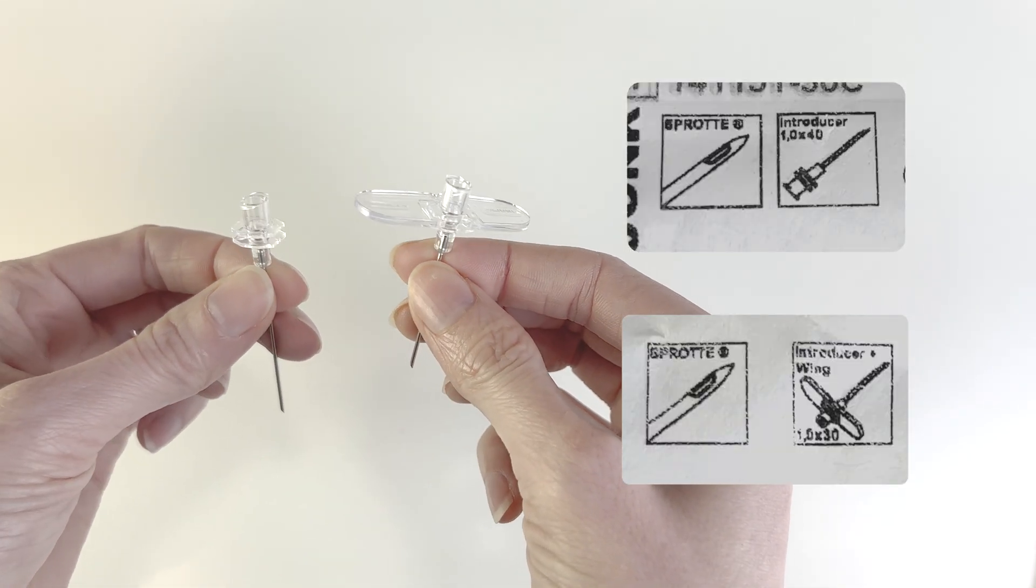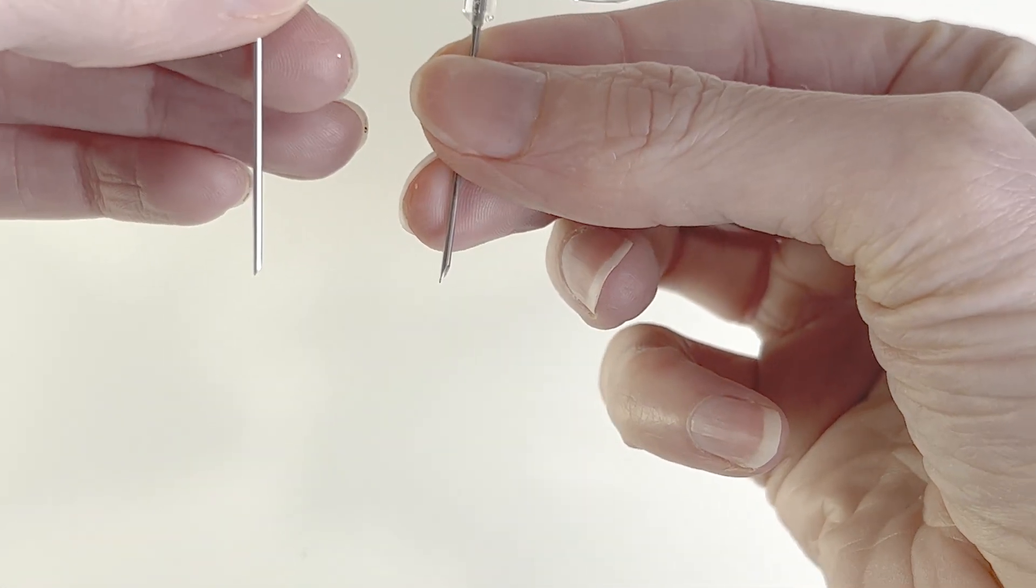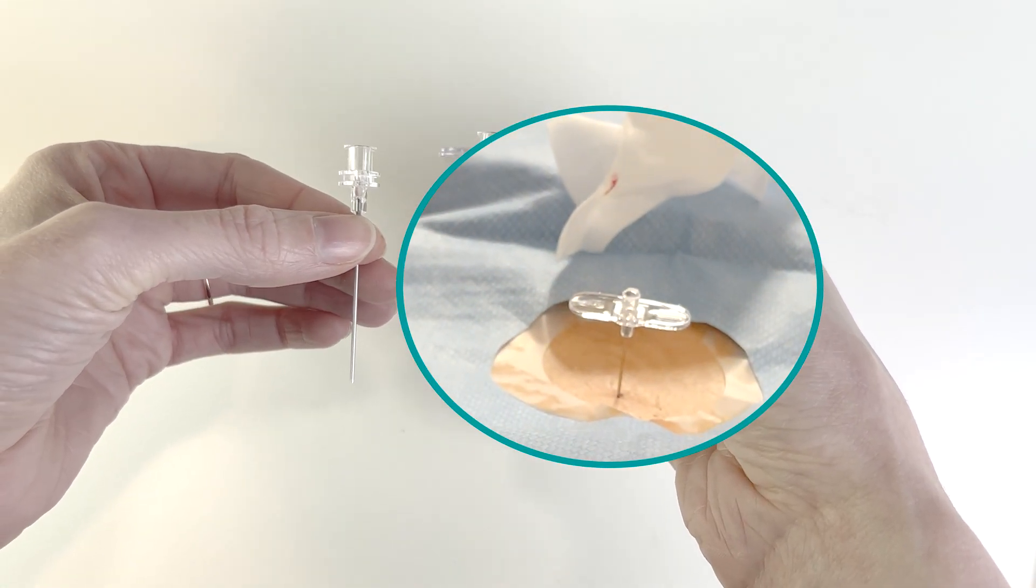As you can see from the packaging, one is basic and the other has wings. They have very sharp, traumatic, tapered tips so that you can get through the skin and muscle. These are short and not designed to go in the CSF space.